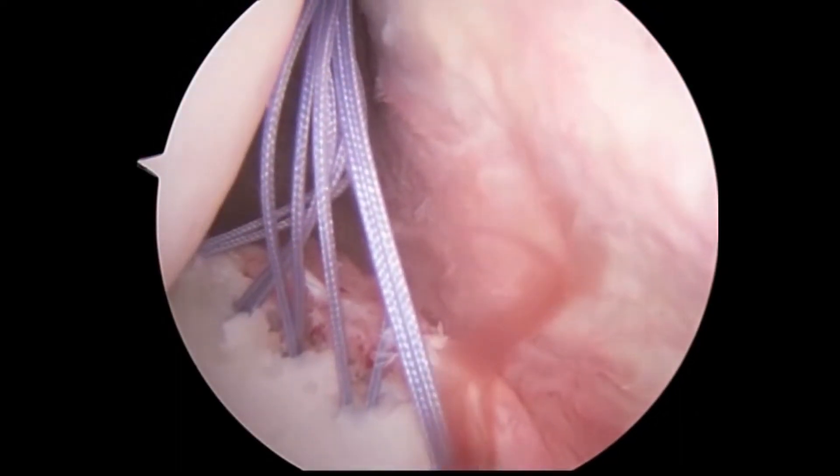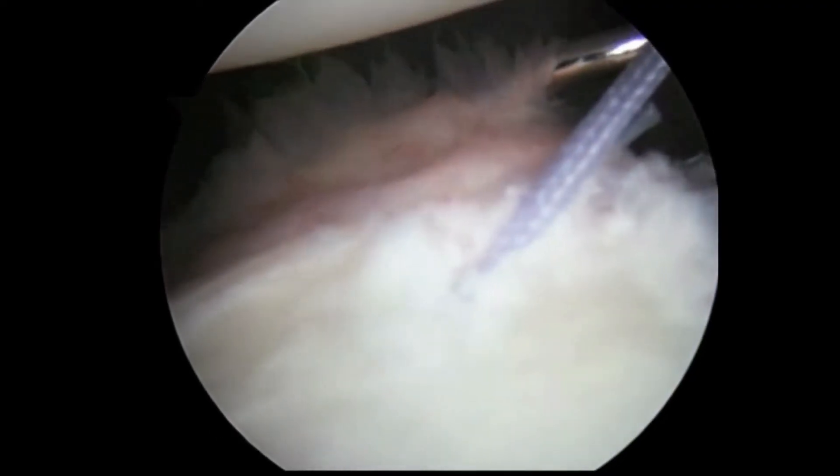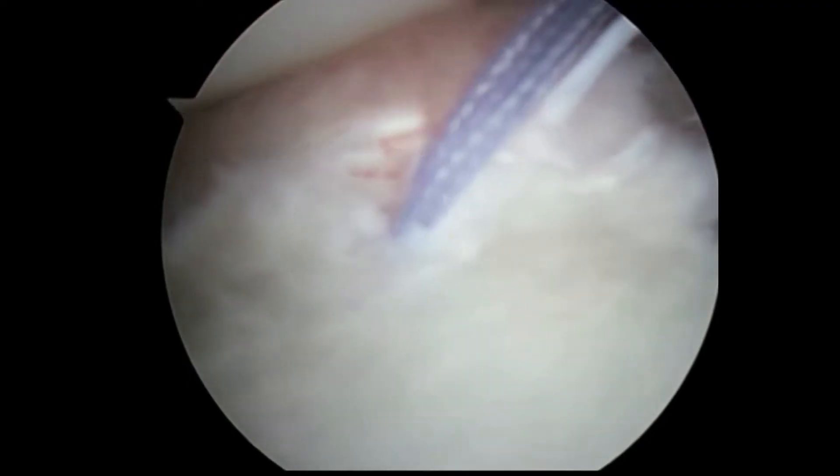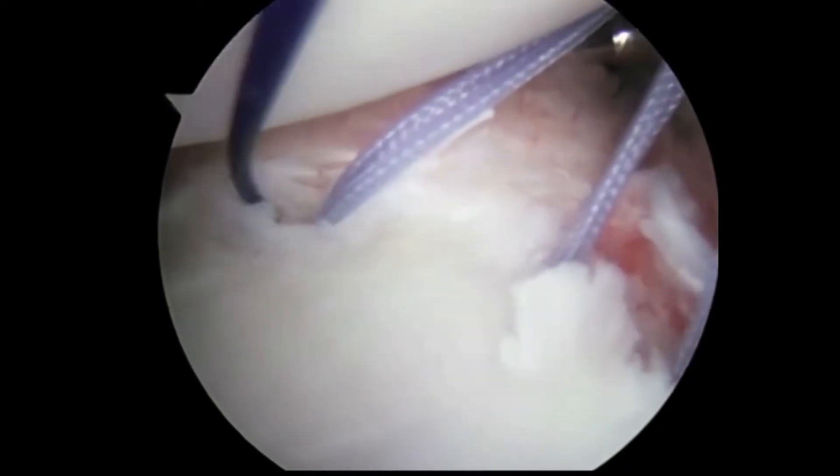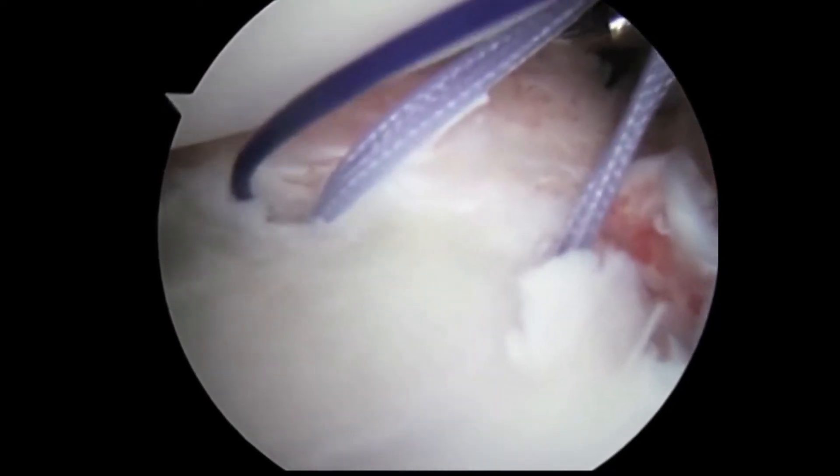Now that we have placed the anchors, we must pass the suture through the labrum to be able to secure it back to the bone. We are using a shuttle needle to bring the suture, collect the suture, and pass it through the labrum.